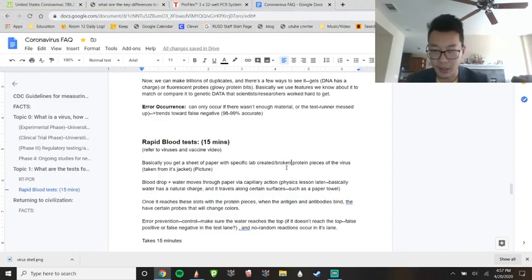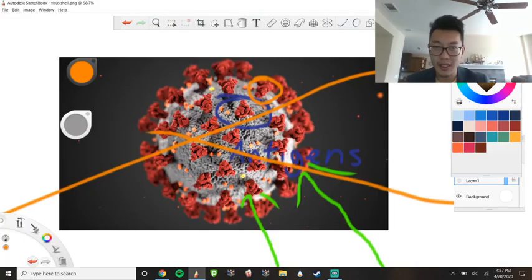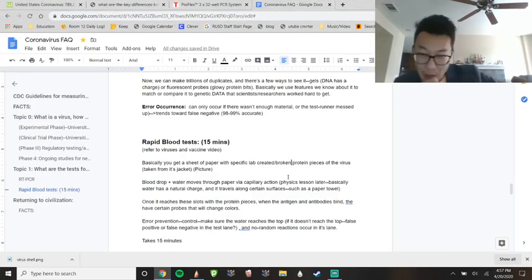So you can't get sick from these tests. It's literally not possible. But the main focus is we want these little nodules on the outside. Remember what the word was? Antigens. So we smeared those on that piece of paper.